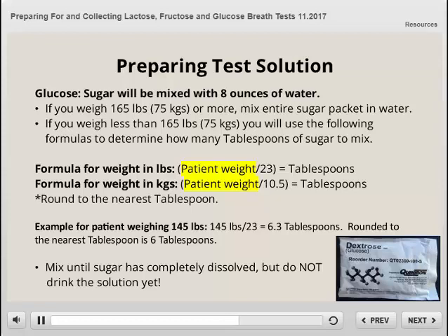As an example, for a patient weighing 145 pounds, we would divide 145 by 23 and get 6.3. Rounding to the nearest tablespoon would equal 6 tablespoons. When mixing, make sure to mix until the sugar has completely dissolved. Remember, do not drink the solution yet, as you will collect one breath sample prior to drinking the solution.